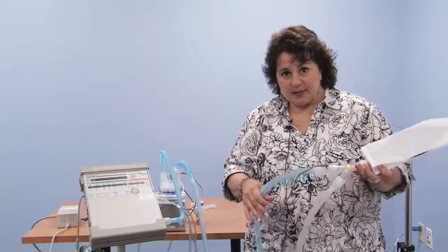And what we recommend in those situations is to increase the sensitivity just by 1 to see if it solves that problem with the air leak. You may need to put a little more water or air in the cuff of the tracheostomy tube if it's present. Certainly you'll want to drain the water out of the hoses for the ventilator.